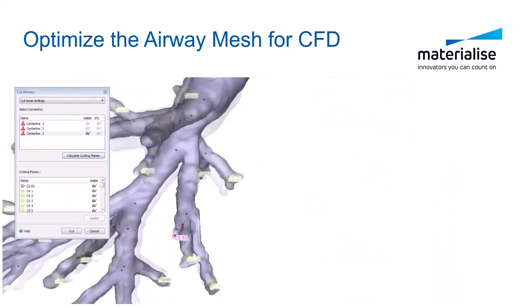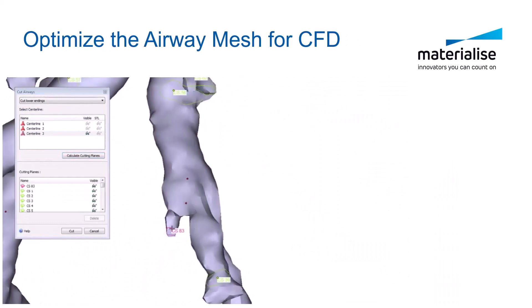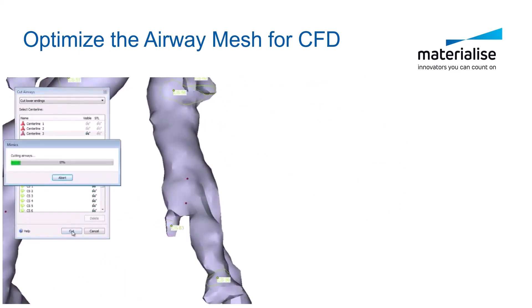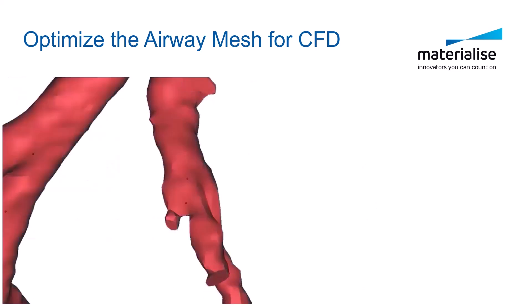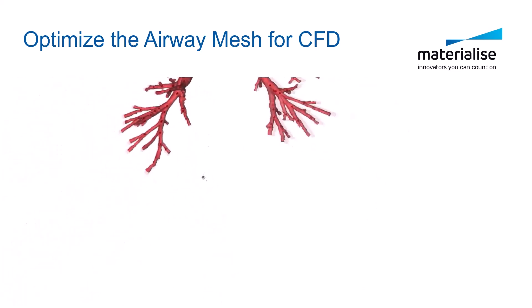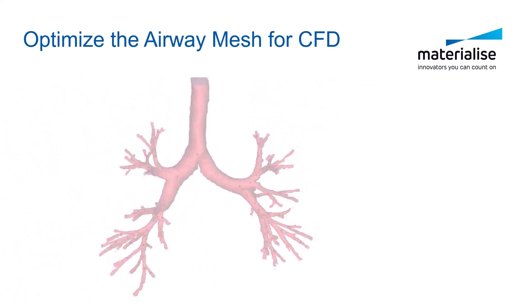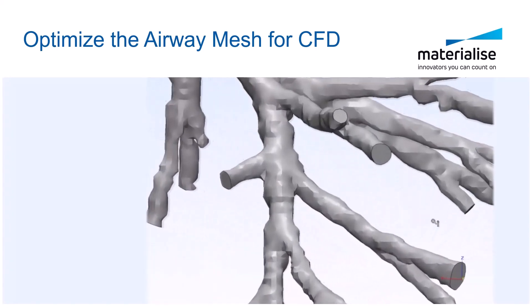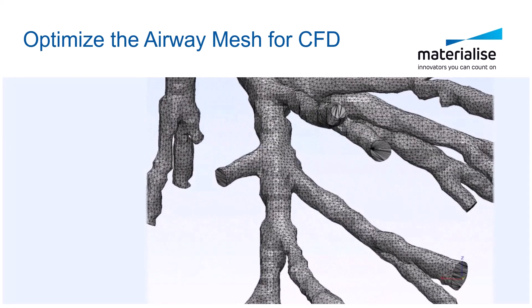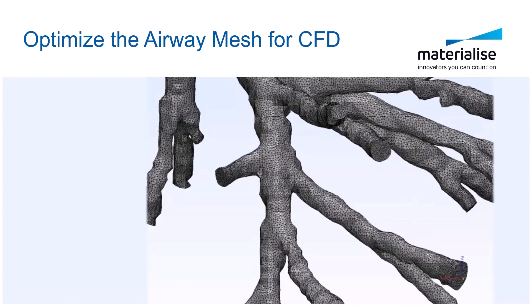To better prep the airway for CFD analysis, prepare the inlets and outlets by creating labeled surfaces for setting up your boundary conditions. Optimize the mesh to more uniform surface and volume elements and use the direct exports to your CFD package.